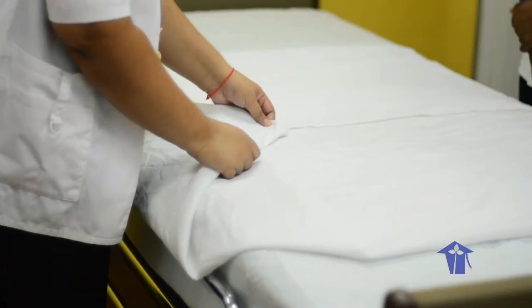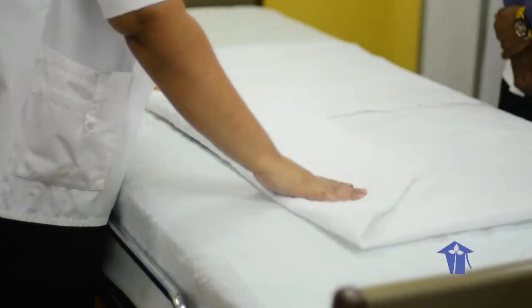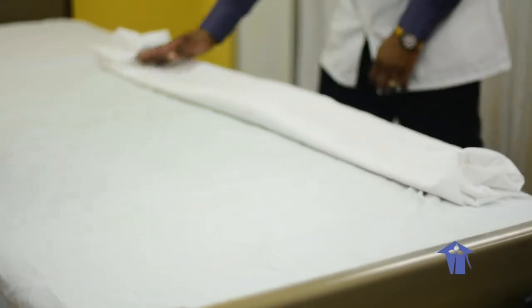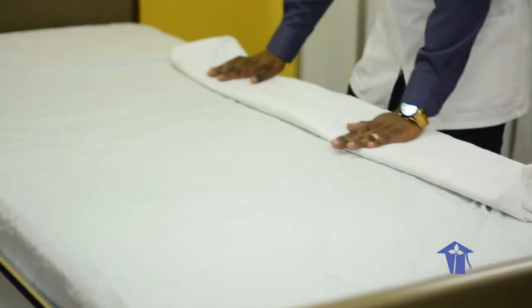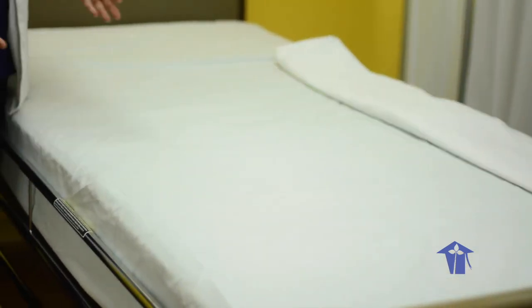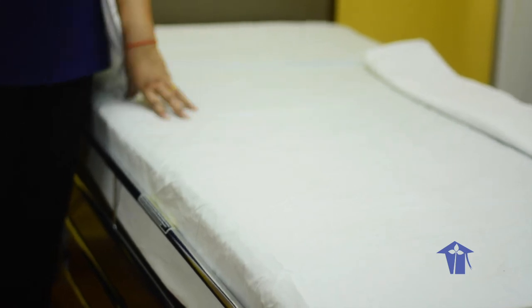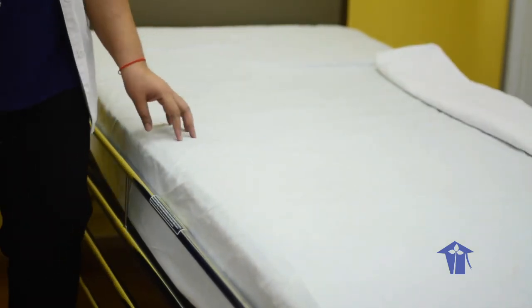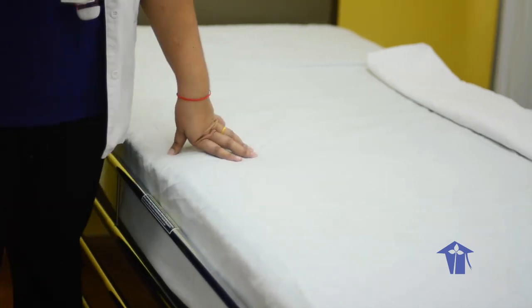Bring this to here, and you flip, flip, flip. And that's another way. Okay, so those are 2 theatre beds. Again, you bring your patient in here and you unfold your sheets. All right, so those are the 3 types of beds: occupied, unoccupied, and theatre bed. Thank you very much.